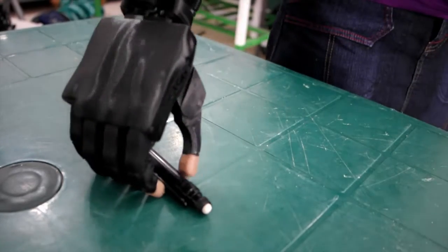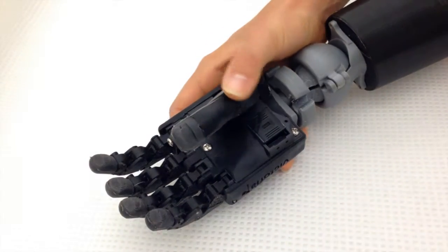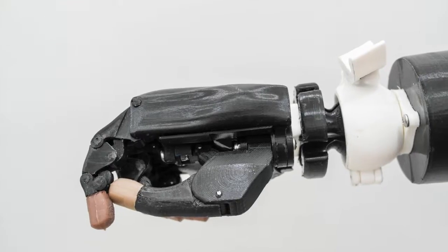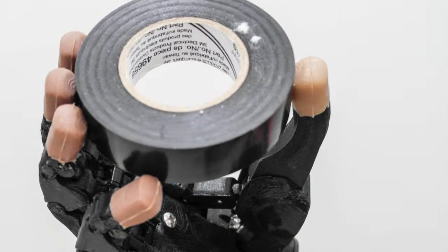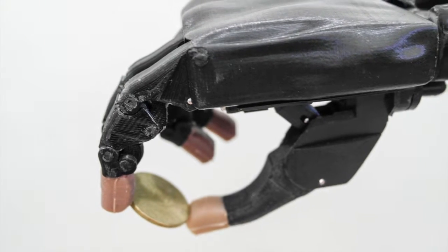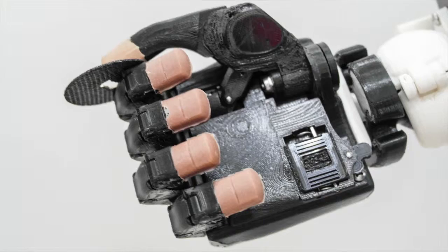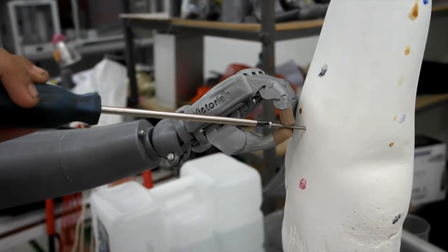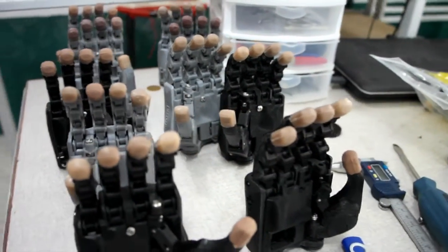Adaptive grasp allows the fingers of the hand to form around the object that it's holding. The thumb can rotate 120 degrees, and this rotation enables the hand to perform seven different types of grip. Since 3D printed plastic is slippery, we've added rubber to the tips of the fingers and thumb to provide extra grip.